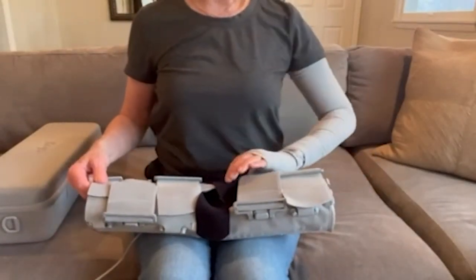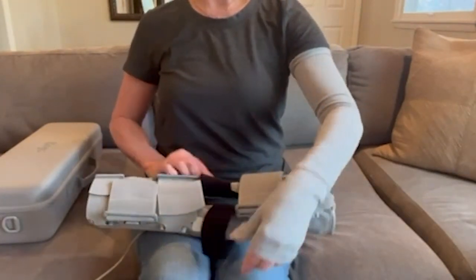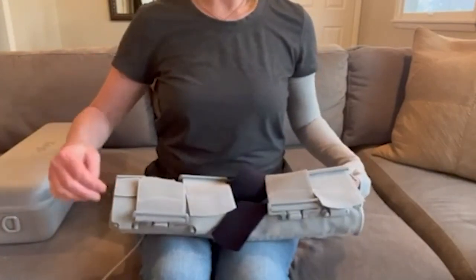Prepare your garment by opening one side of each of the black straps. Loosen the other straps by lifting each clip and pulling the adjustable strap to form a loose cone shape.